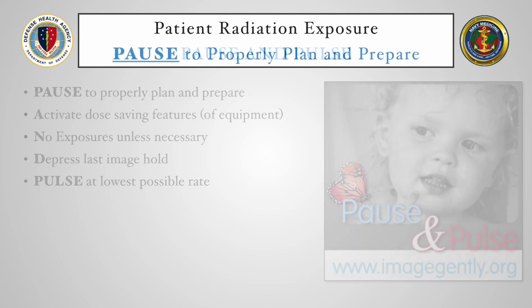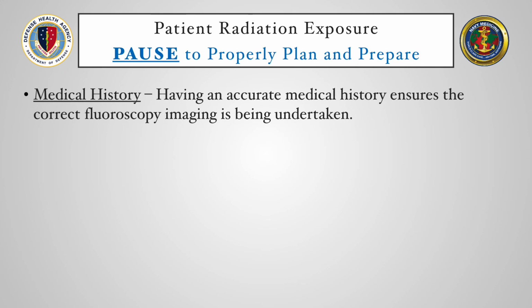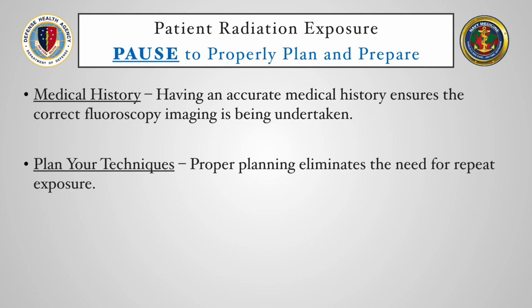When pausing to properly plan and prepare for a study, look at the medical history. Review any medical or surgical history. Review any available prior imaging, which can help to identify unusual anatomy. Plan your techniques. Radiologists and technologists making a plan of how to image a patient can decrease fluoroscopy exposure time. And when working with children, be as flexible as possible.